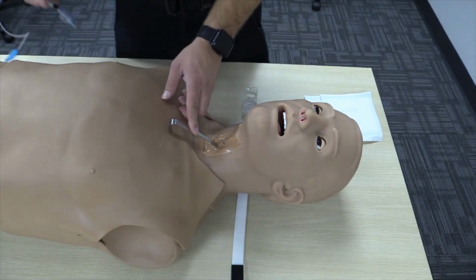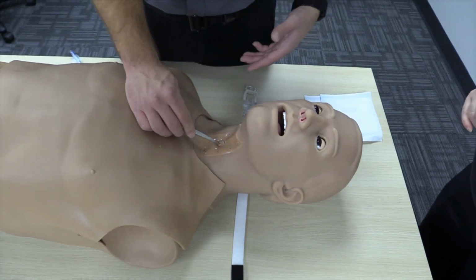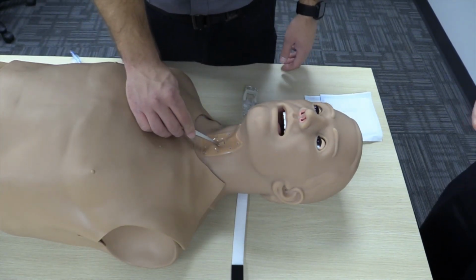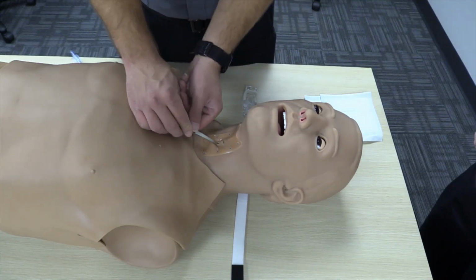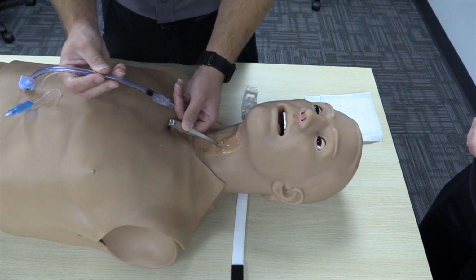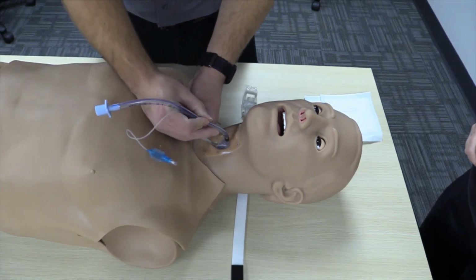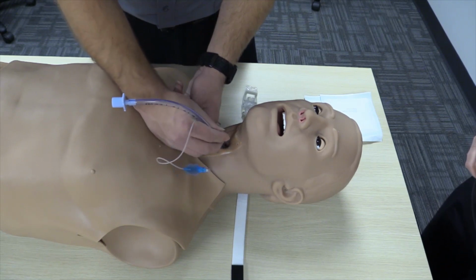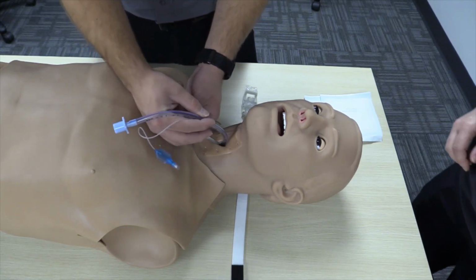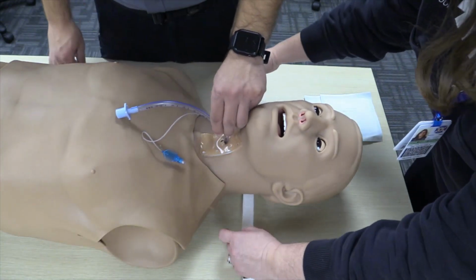After we've removed our needle and our forceps, we're going to either take our finger to dilate and hold the place of the cricothyroid membrane, or we can take our J-hook or tracheal hook and place it in here, such as this. Then we could take our ET tube and pass it into the trachea. One thing to remember is the second that this balloon is past the skin and into the trachea, we are done. Now we're going to remove our hook.